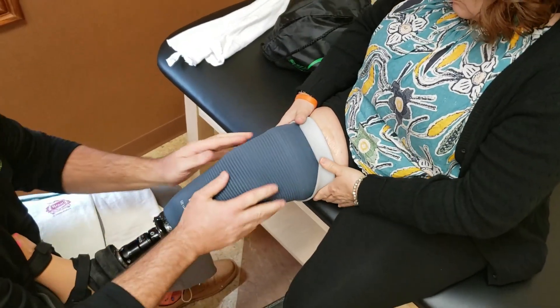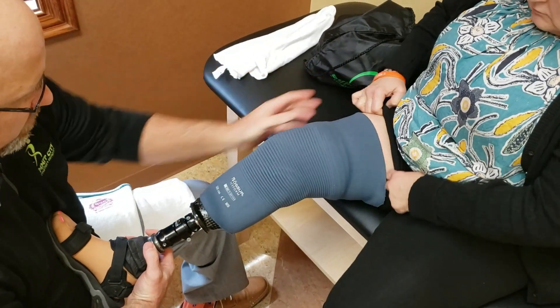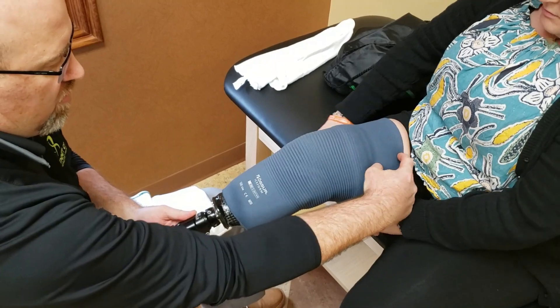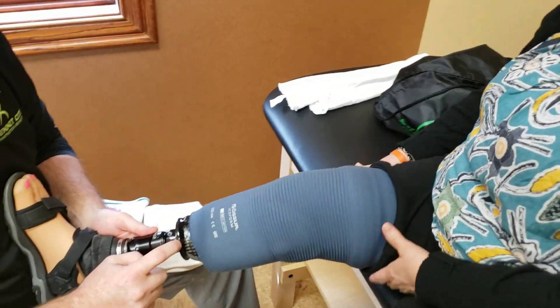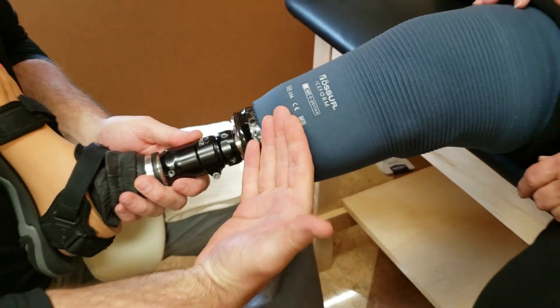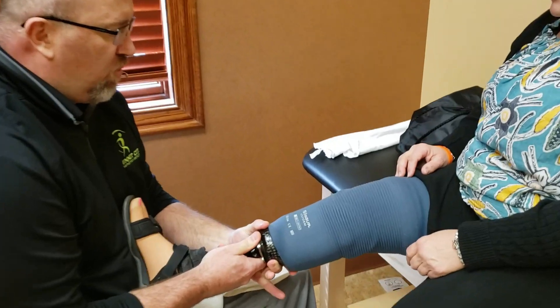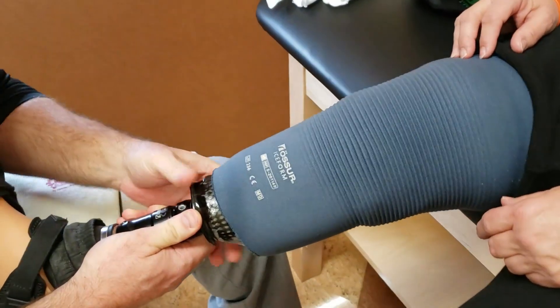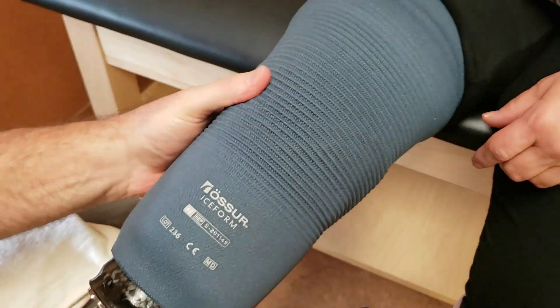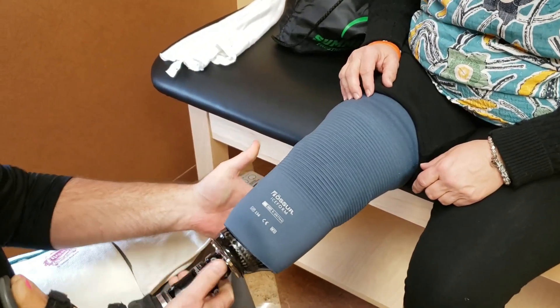For suction to work well, we need good skin contact with the sleeve. What's holding the prosthesis on is not the sleeve itself — it is simply an air barrier between you and the prosthesis. In this little coupler down here, there's a one-way auto-expulsion valve that lets any air inside escape through displacement and pressure. As we push, you can start to see the sleeve is being drawn down tight against the socket and limb. With every step you take, it just gets a little more secure.